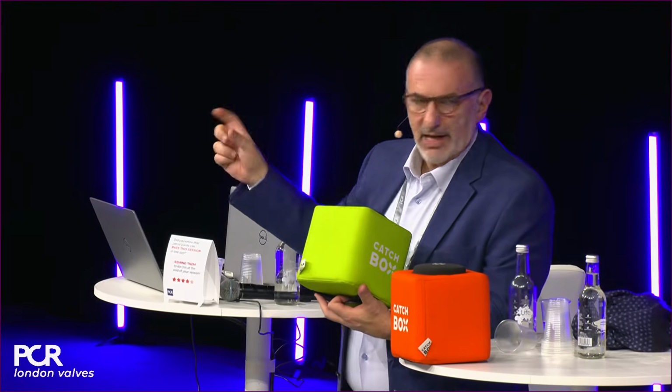If you look back at that picture though, there was one, then the middle one was slightly off the center, and then one on the right. This is slight commissural misalignment, but then you also have the C-tab in the right position. So overall, this will not be misaligned. It's slightly misaligned. Yeah. Joe, can we get the iPad up?